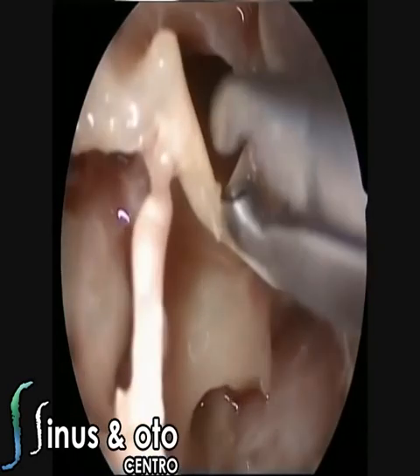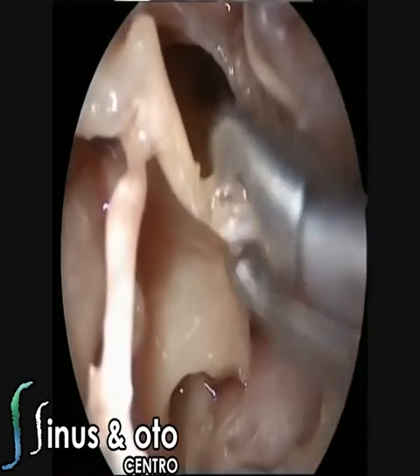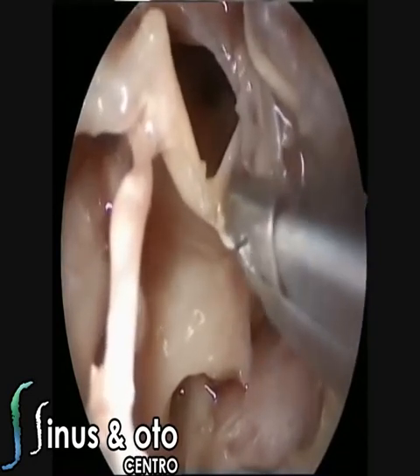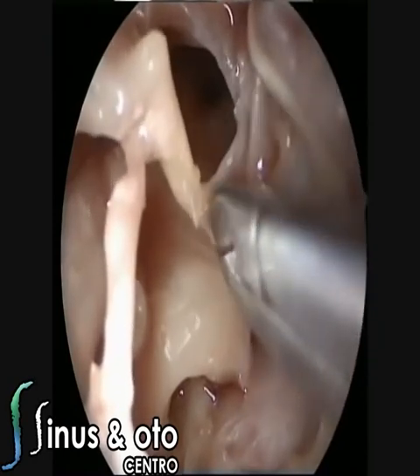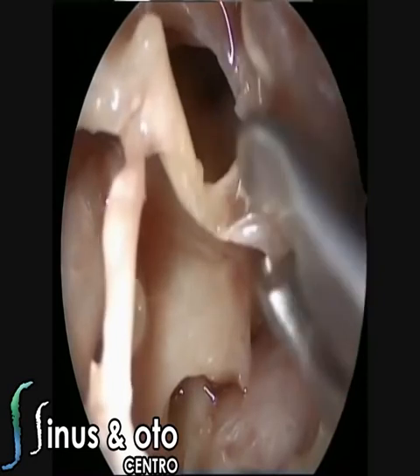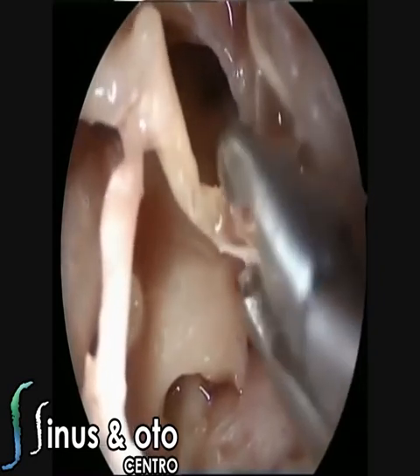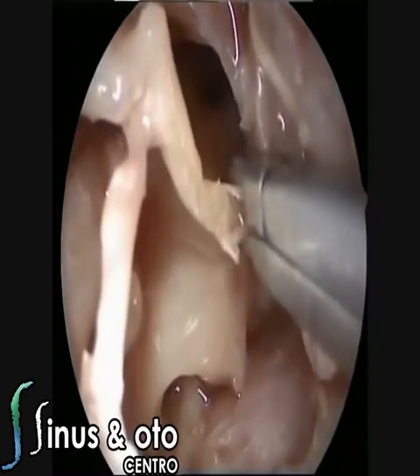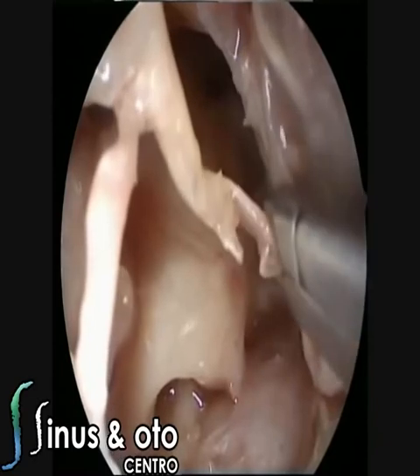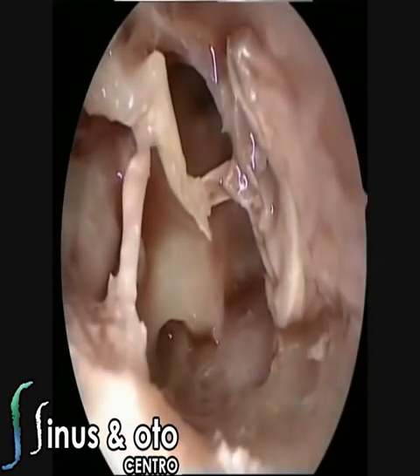And of course, sometimes you can have tearing of this tympanic membrane, but you can reconstruct it during live surgery using perichondrium, using fat if you want, using cartilage. We prefer to use cartilage, the tragal cartilage that you can harvest in a very easy fashion from the tragus, and of course not creating aesthetical problems or creating big incisions.